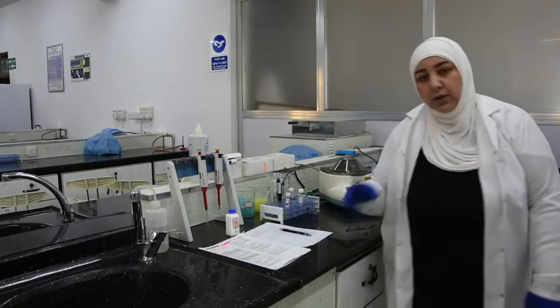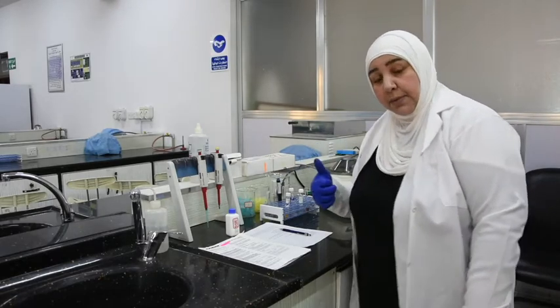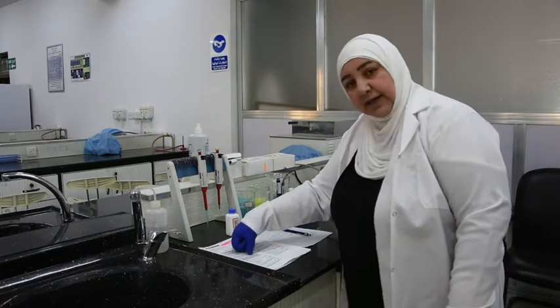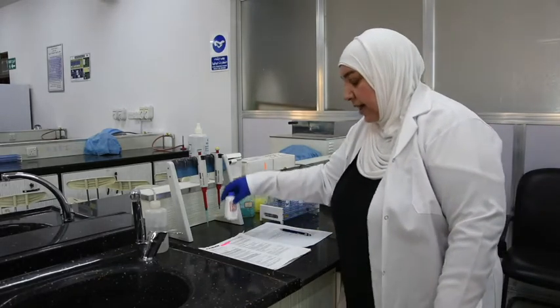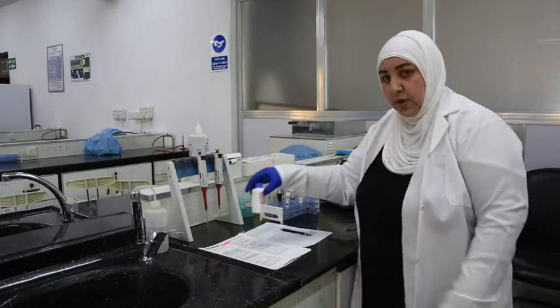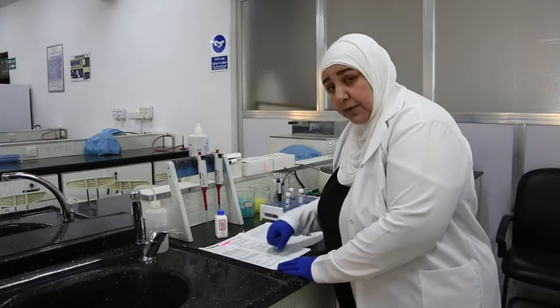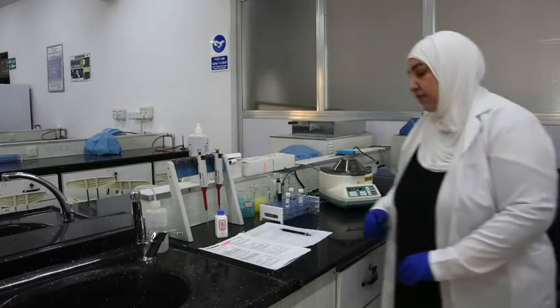This test needs two steps, 1 and 2. Number 1 is to precipitate the LDL, VLDL and chylomicron by using a reagent that has phosphotungstic acid and magnesium ion. We use this reagent to precipitate the LDL, VLDL and chylomicron found in the serum. And then we will see the sequence of the test.